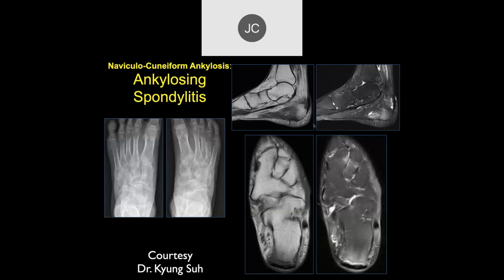So whenever you see, especially a male, coming in with severe back pain and an MR examination, the first thing you should think about is ankylosing spondylitis, because that's when the diagnosis has to be made. And we'll talk about the characteristic early findings on an MR when we get to it. But that has to be treated immediately and not waited on.